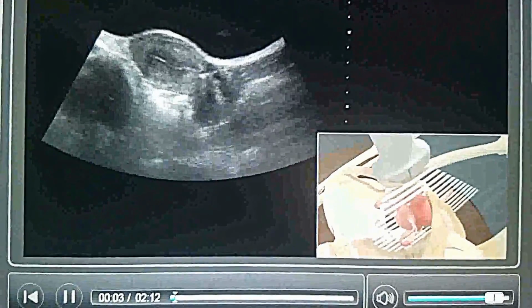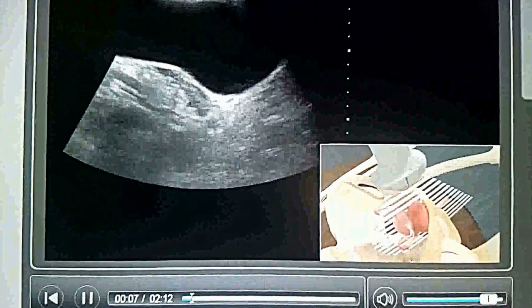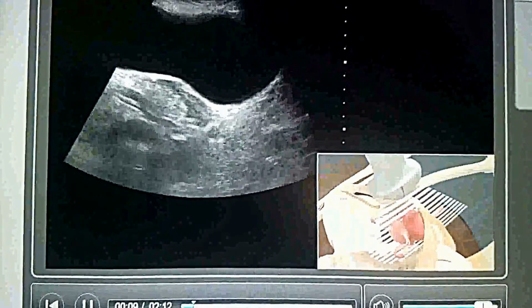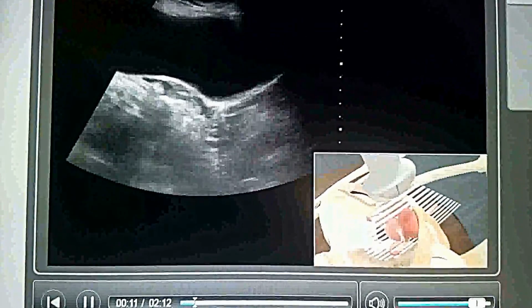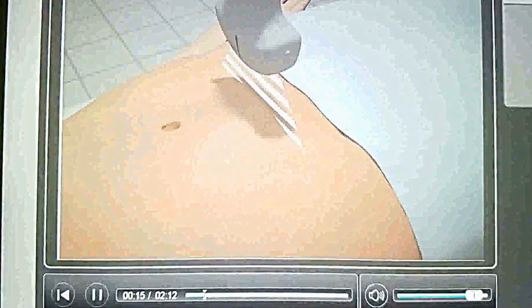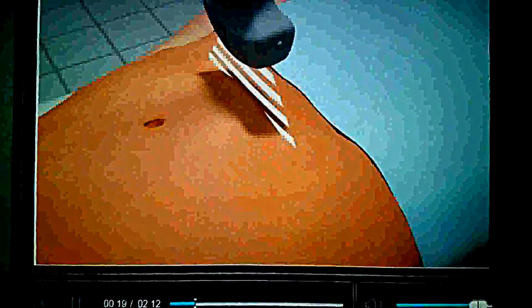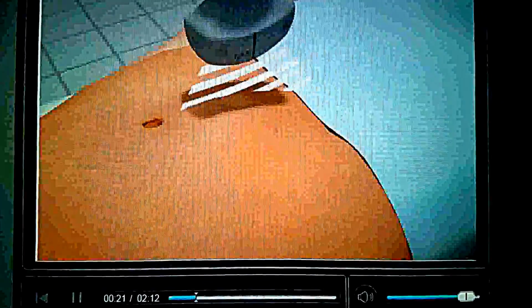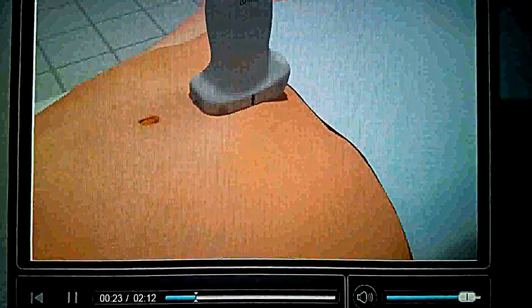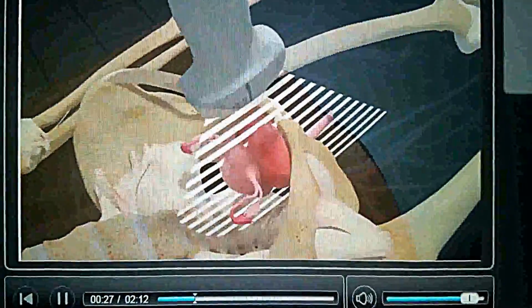Transducer with a pelvis exam type is used to perform the pelvis ultrasound exam. A full bladder is used as an acoustic window to view the pelvic organs. The pelvis is evaluated in two planes. Place the transducer in a long axis position with the orientation marker to the patient's head at the level of the symphysis pubis. Angle the transducer inferiorly into the pelvis.